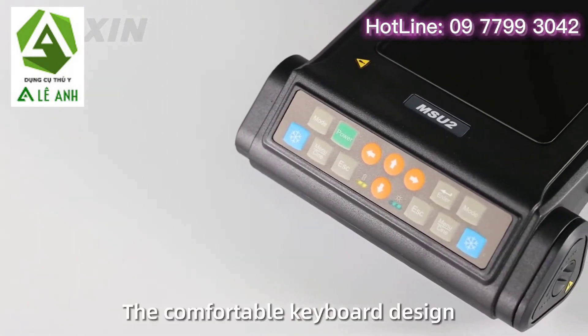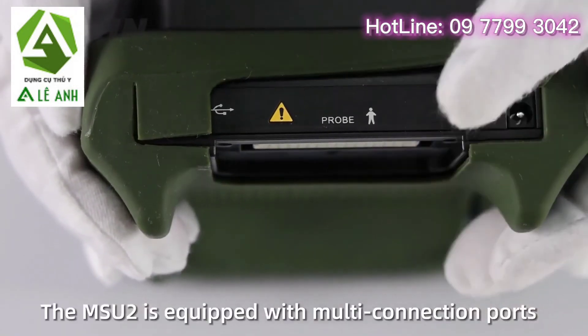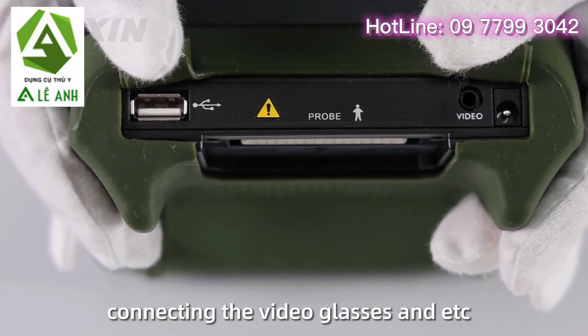The comfortable keyboard design and multifunction interface bring convenience to users. The MSU2 is equipped with multi-connection ports, which satisfies the convenience of charging, storing measurement data, and connecting video glasses.